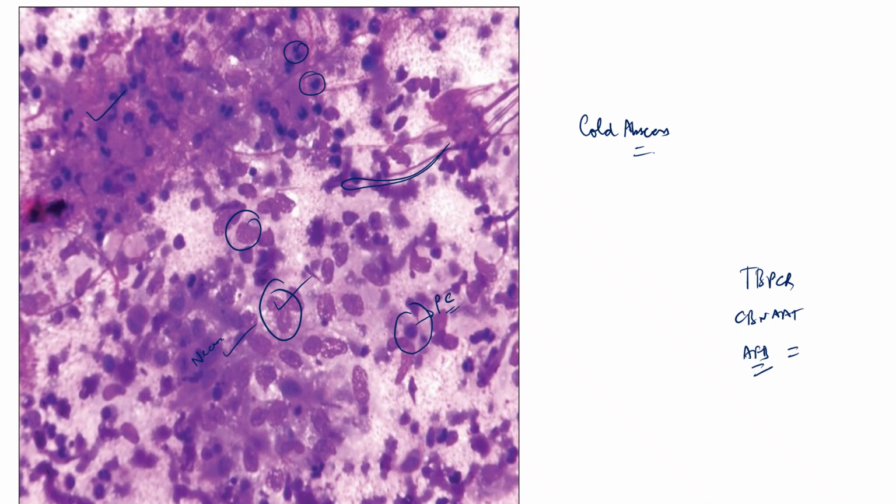So this is how we diagnose when the picture is a mixture of neutrophilic infiltration and lymphocytic and histiocytic infiltration. But please, when you see necrosis, when you see epithelioid histiocytes in a group, do not suggest that it can be bacterial. Cold abscess is still tuberculosis, just a modified version, but do not write that it is not tuberculosis. This is a very common mistake made by new pathologists who are still learning various manifestations of tuberculosis. So this is one.